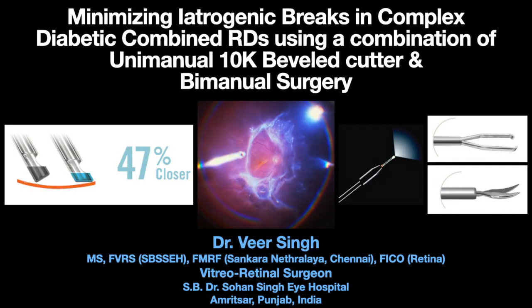In this video I would like to show how to minimize iatrogenic retinal break formation in complex diabetic combined retinal detachment using a combination of unimanual 10K beveled cutter and bimanual surgery, and what is the right point to switch from a unimanual technique to a bimanual technique.